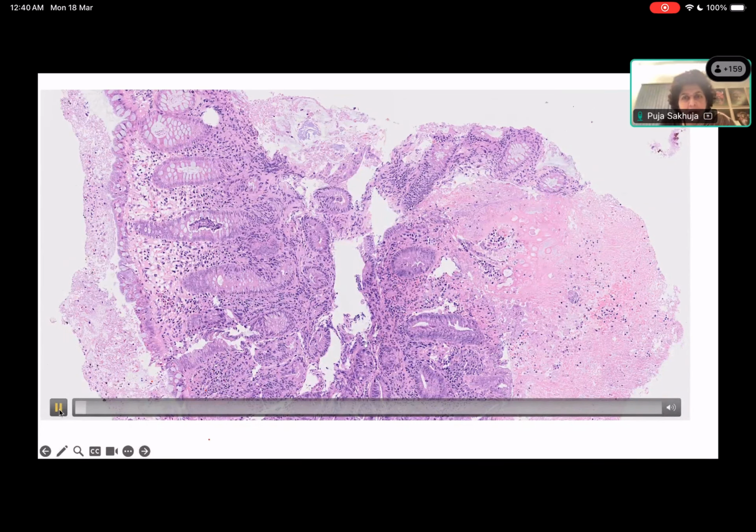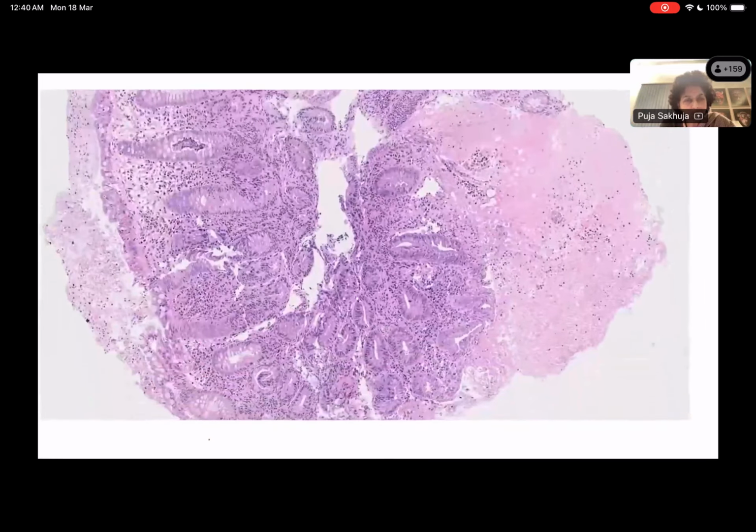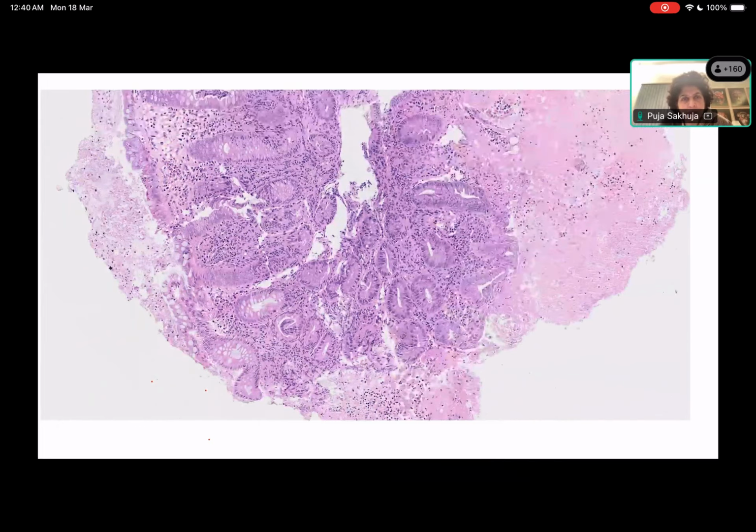Yes. This was just that area, and then we have put it into higher power, and then just gone through the slide the way one would normally see it, going into high power and then going from one side to the other, top to bottom, whichever pattern you follow, and then seeing the slide accordingly. Okay.